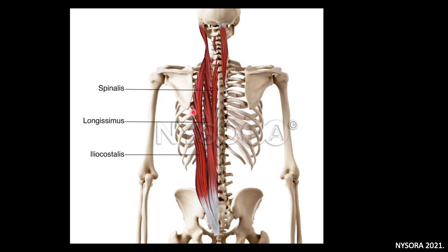So it's not like there's going to be one clear fascial plane. Try to not think about this as just one obvious muscle that you will definitely get underneath and then float up and then thread a catheter and it's going to be great. There's a lot of variable insertion points in the erector spinae muscles, and there's a lot of striation and a lot of different muscles back here, and it's not as straightforward to put a catheter underneath it as you might imagine it would be.